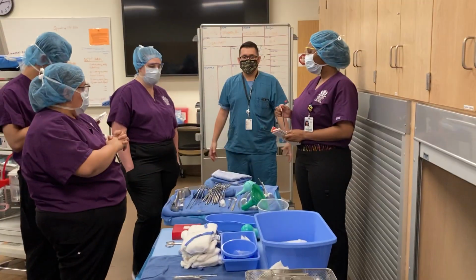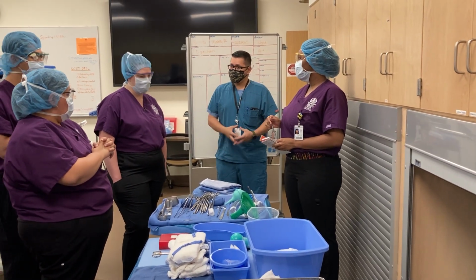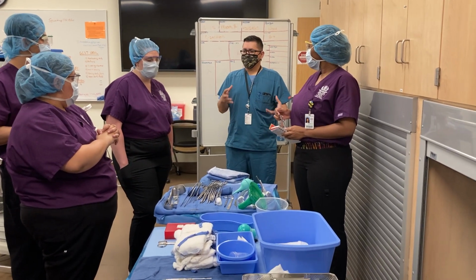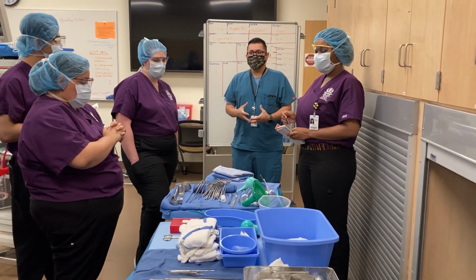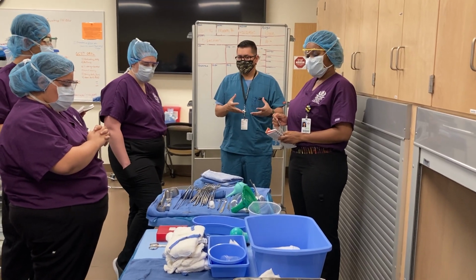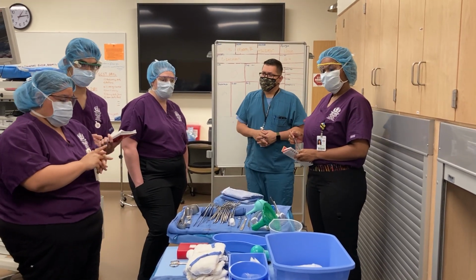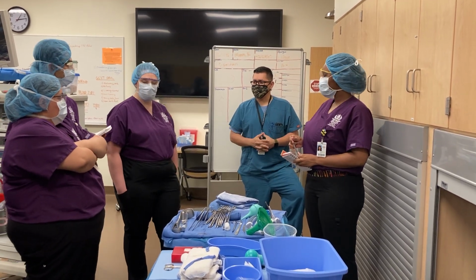The bladder, why is that important? Are we doing any surgery on the bladder? But is the bladder there? Yes, you guys know the anatomy. The bladder is right around, again, that mons pubis area. Do we need to get it out of the way? Yes. Okay. Instrumentation-wise, do we have instrumentation necessary to get the bladder out of the way with the exploratory lap setup or laparotomy or a major tray in this sense? Kind of, sort of, right? Get it out of the way with the retractor. We have retractors that can do that.